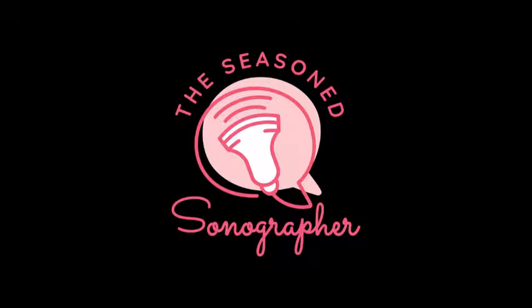The abdomen circumference. You want to measure the abdomen transverse at the level of the stomach and the umbilical vein. You can see that portal sinus junction. You can also see the spine in transverse with those three ossification centers of the spine forming a V. You can see the aorta in cross section.